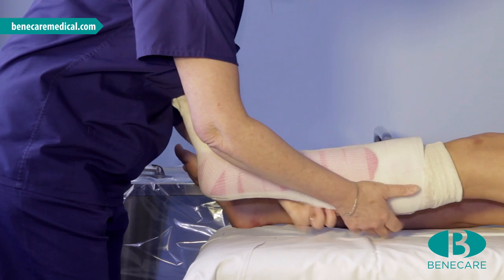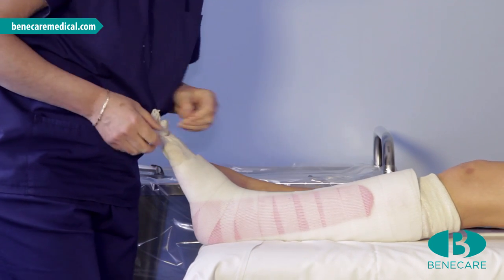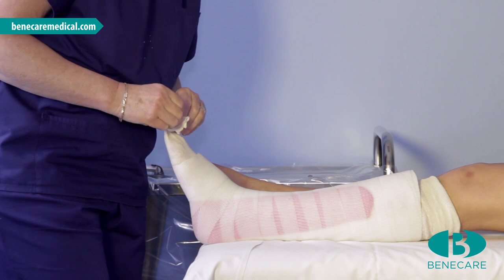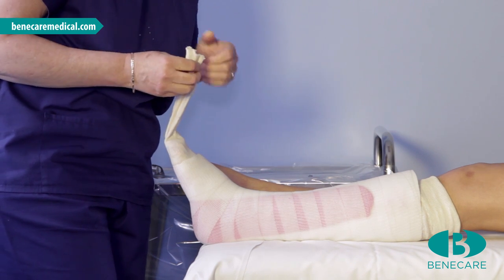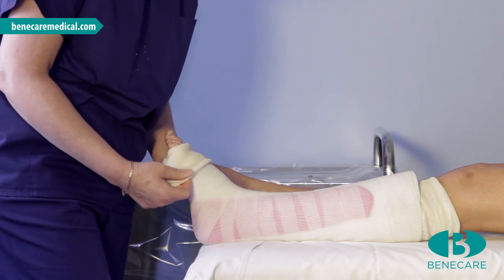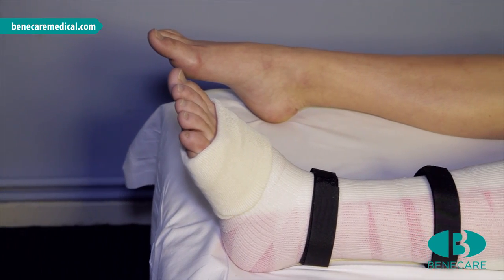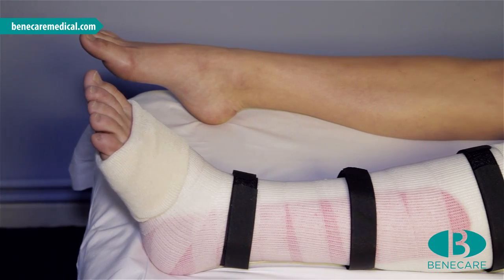There are a number of ways to secure the cast, by bandage or hook and loop. Fold the stockinette back to ensure the limb is protected. This is the finished below-knee combi-cast.